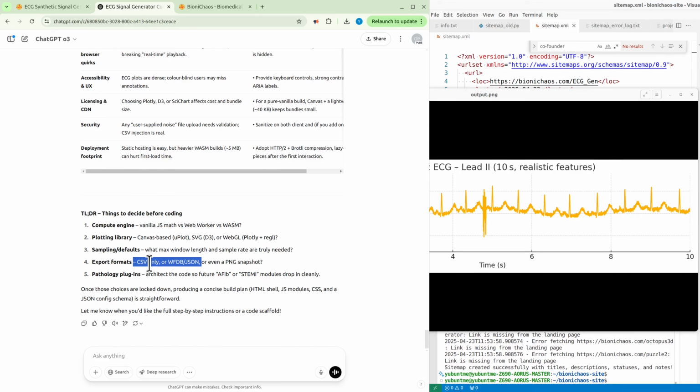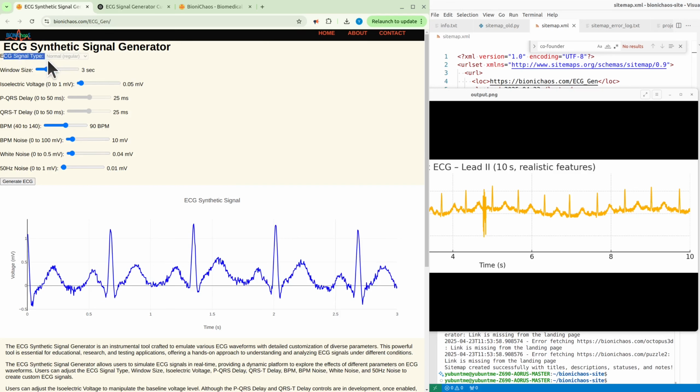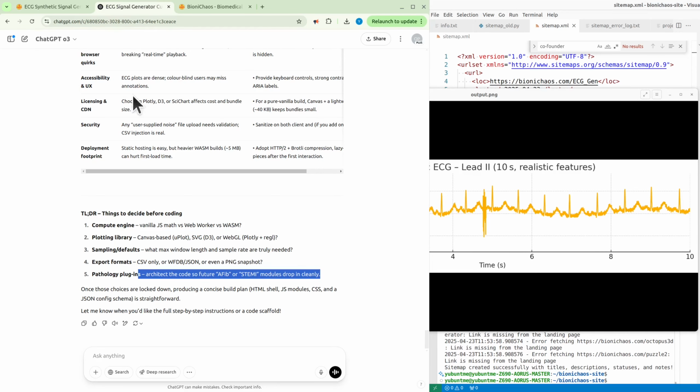Export formats. Yeah, we could export it as an image, be nice and easy. Pathology plugins: architect the code for future A-Fib and STEMI modules, drop in cleanly. Yeah, the question is, should we be introducing those to begin with? That was another thing that is currently not available in the current web application. It's that drop-down for changing a normal, supposedly the drop-down should have abnormal, A-Fib, so on and so forth.